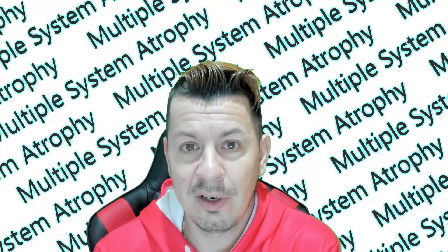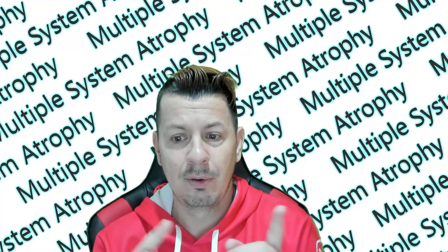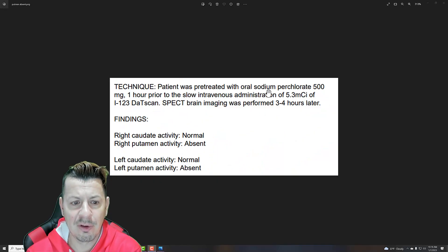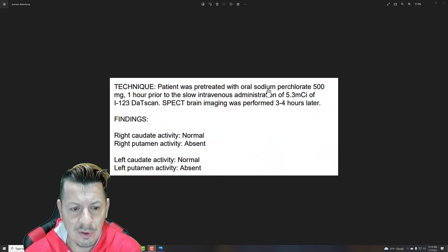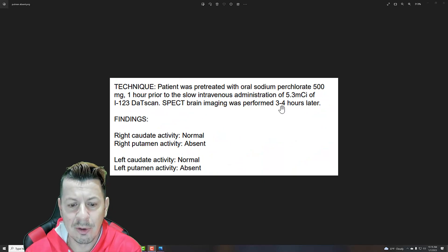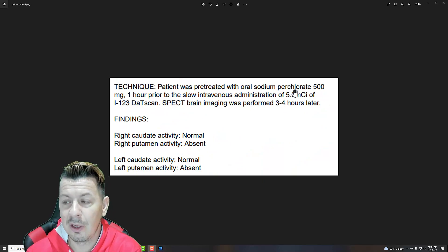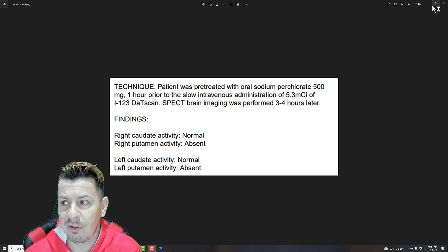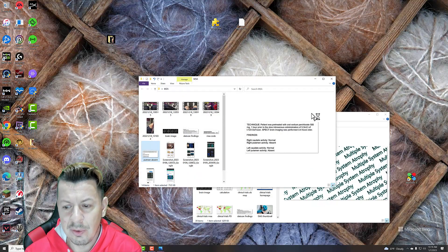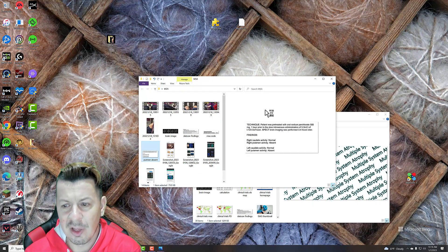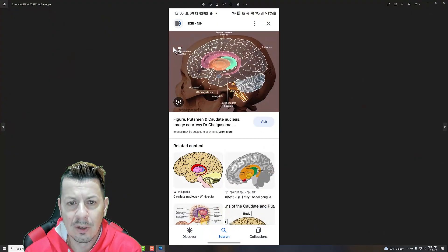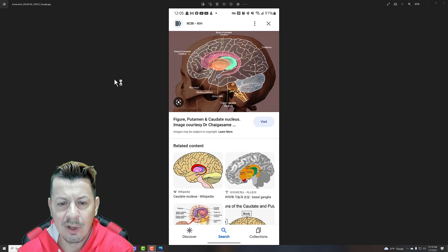I spent three or four days trying to find the data for it — to find normal and abnormal — but I found it. So if you remember here on my screenshot, it shows the caudate date is actually normal, but the putamen is not. Just remember that the caudate was normal for myself, and the putamen activity was actually absent. They put some liquid in you and then they look at you. I found a picture online — I'll give some references in the comments — from the National Institute of Health.